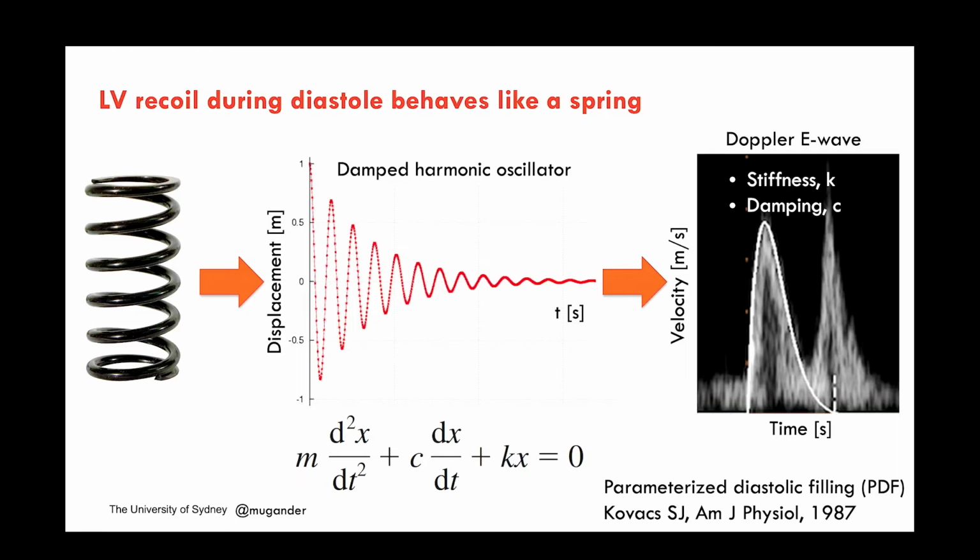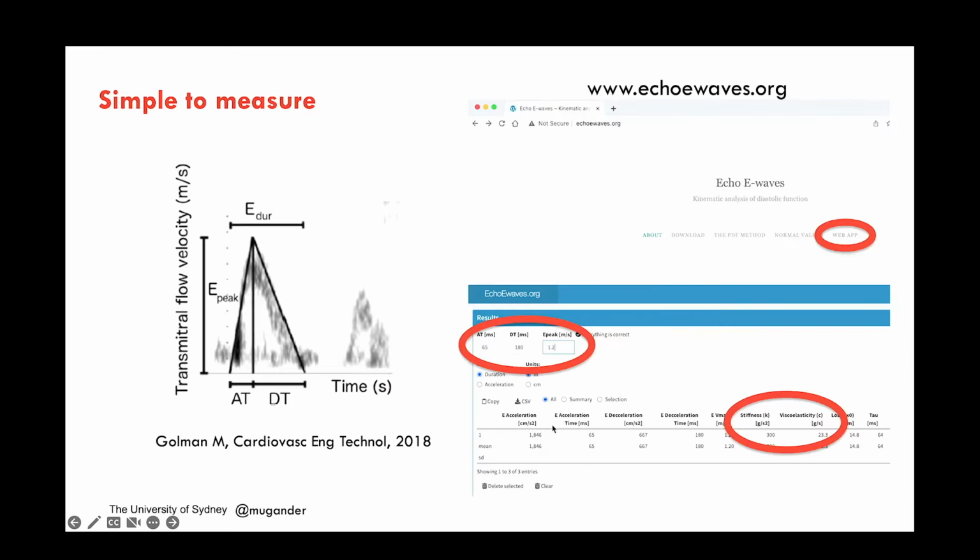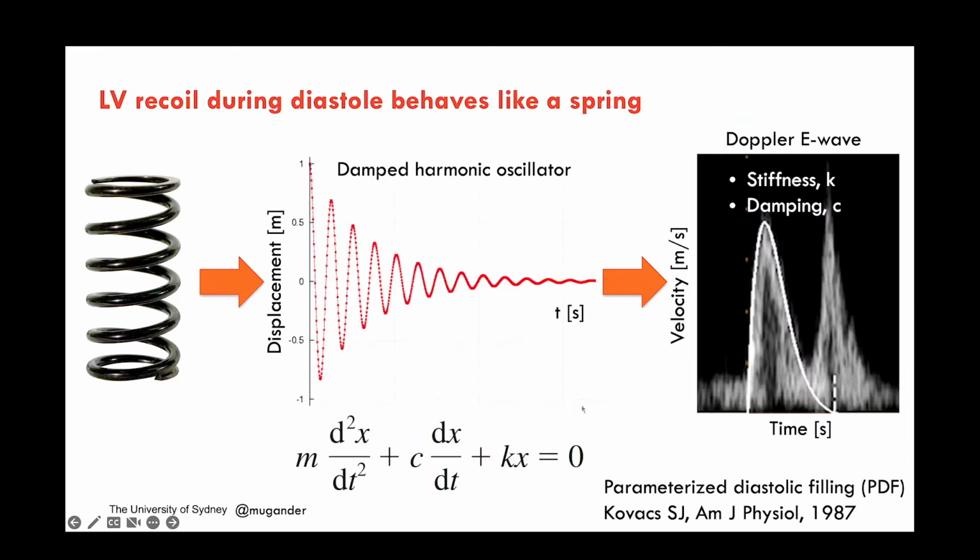And it turns out that left ventricular filling behaves exactly like that. Boing. And so here we see, for example, by analogy, the displacement in some distance over time that is reduced, and there's a formula for that. Let's just accept that there is a formula for a moment. And it turns out that the E wave can be traced by a function that behaves according to that formula.